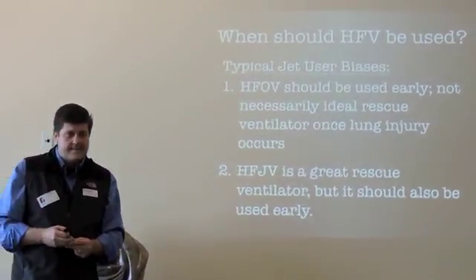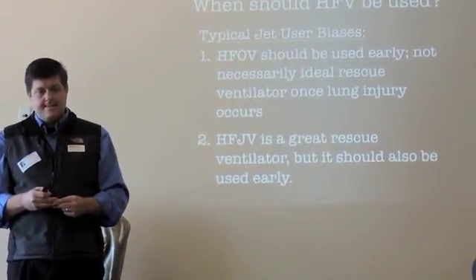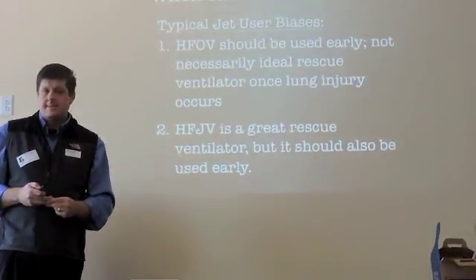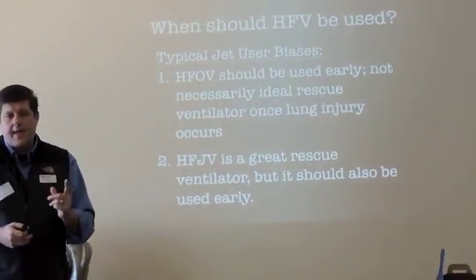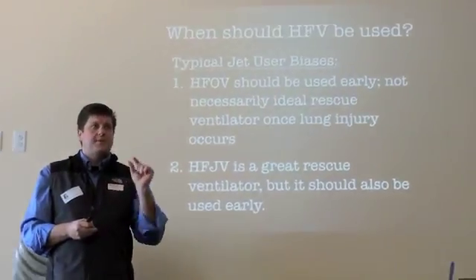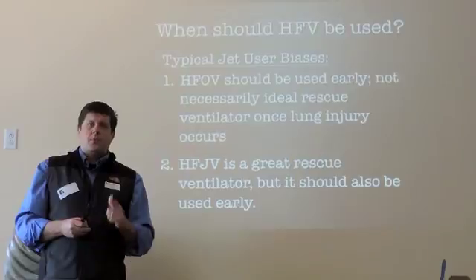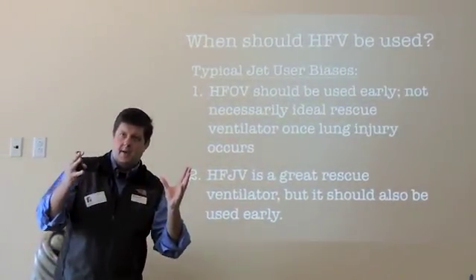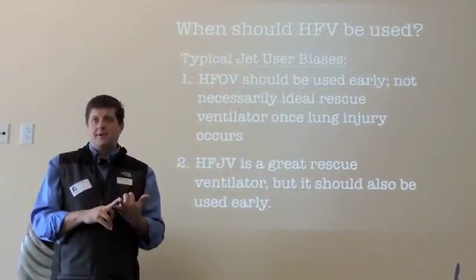Peggy, can you talk about cannot meet PIP? Right now we have a patient that Gabe just got called for. And of course, off and on, they keep getting that with this particular patient. Cannot meet PIP alarm? That specifically means the jet for 3 minutes is trying to stabilize the PIP with the servo pressure, and it can't. So we're having weird pressure fluctuations that are beyond the realm of normal. So that's either a mechanical issue or a patient issue.